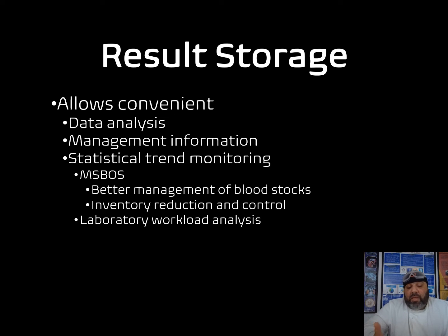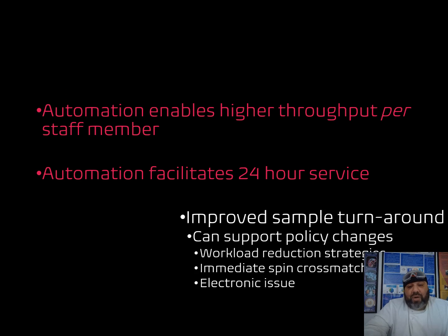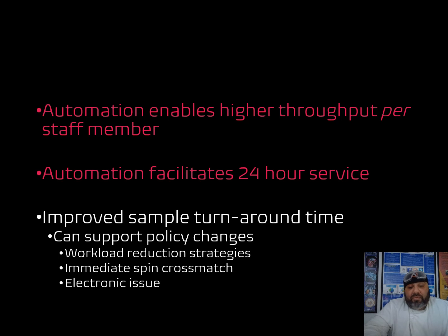And as mentioned in one of the previous slides, the workload analysis can be assessed through conducting particular audit trails through pathology automation. And so following this, automation enables a higher throughput per staff member. Automation facilitates a 24-hour service, and there is improved sample turnaround time, and it can support policy changes if and where applicable, pertaining to laboratory and pathology practices. Workload reduction strategies, if required.